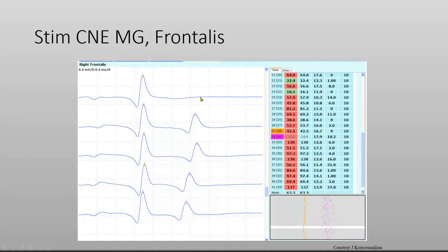This must be tested by increasing the stimulus strength ever so little. If it is a stimulation problem, the signal will be recovered. If not, it is localized to the neuromuscular junction.